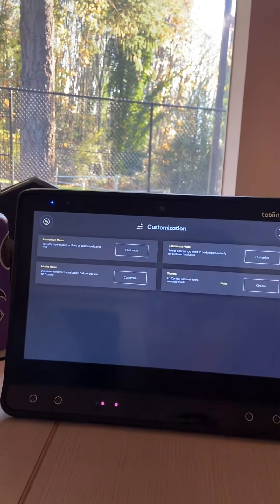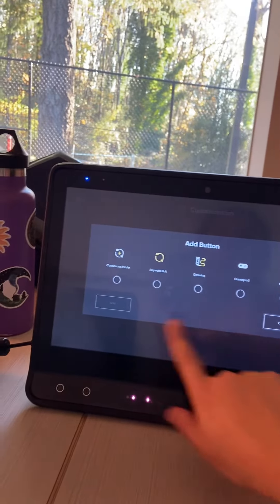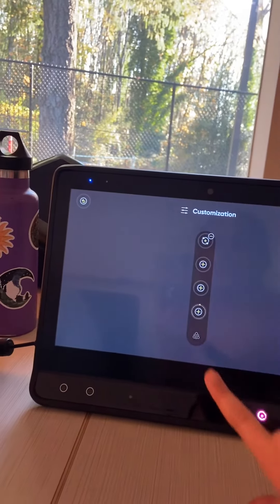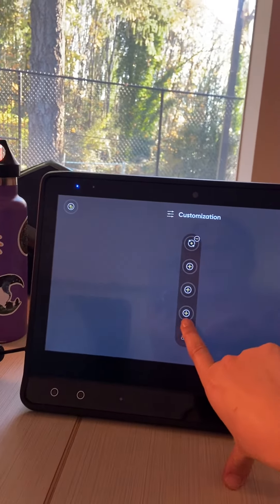And you want to scan to the next one, go to customization, and you're going to want to go to modes menu to customize.